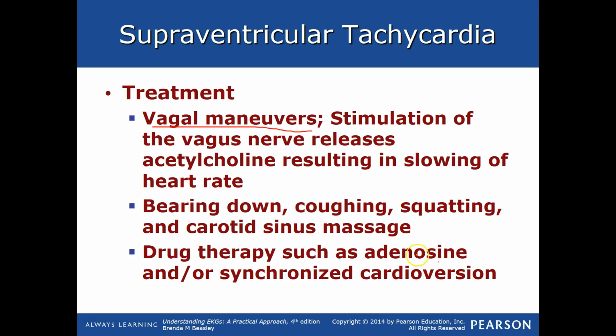This is for someone who's not sick, because if they're sick, if they're having chest pain, bad blood pressure, all of that, then we're going to do synchronized cardioversion. We're going to go over these things when we get into ACLS, about how we do synchronized cardioversion and what the dosage is and all of that.